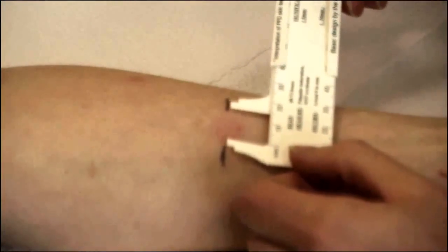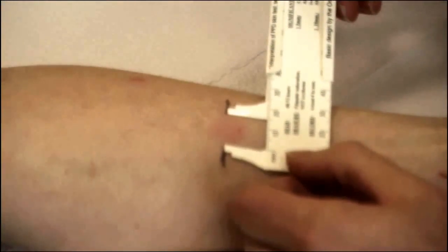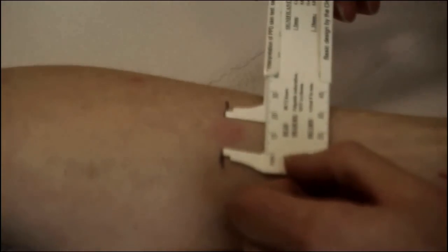If the induration is 10 millimetres or greater, then it is considered to be a positive result in most healthy individuals. Please call Algoma Public Health to report any positive TB skin tests.